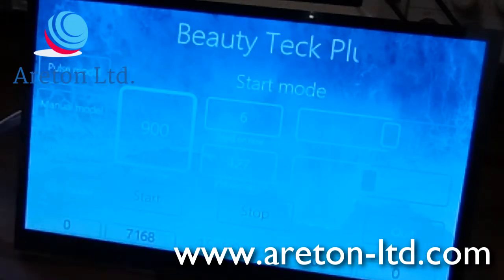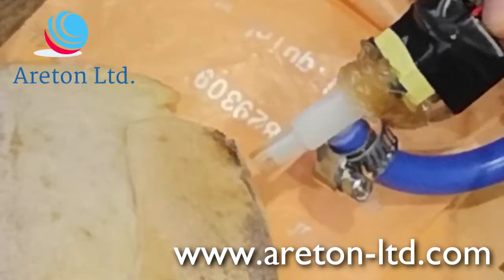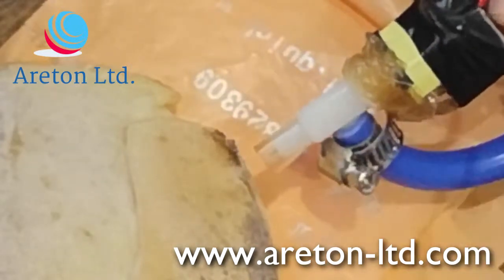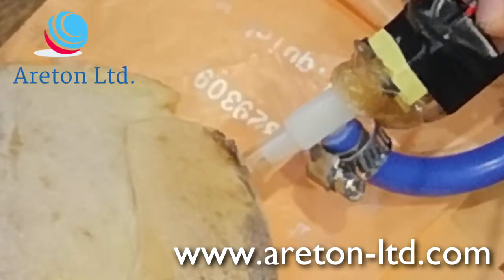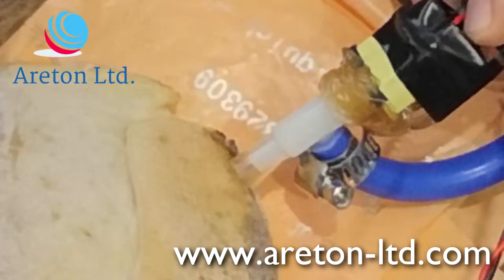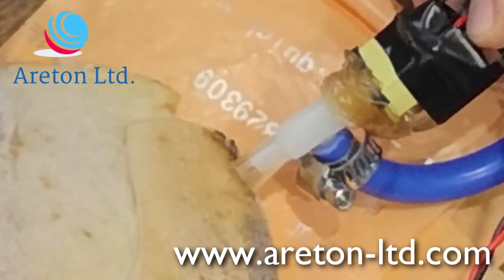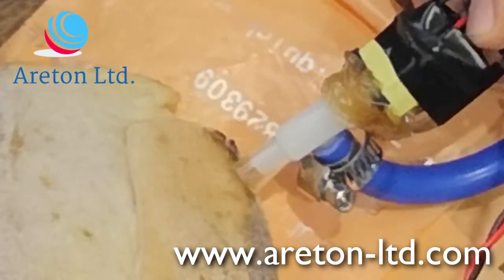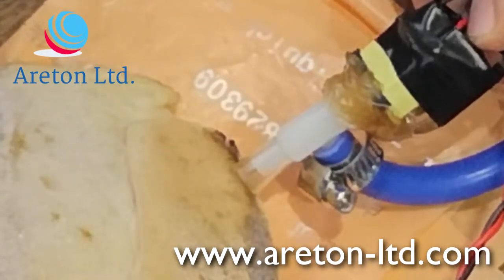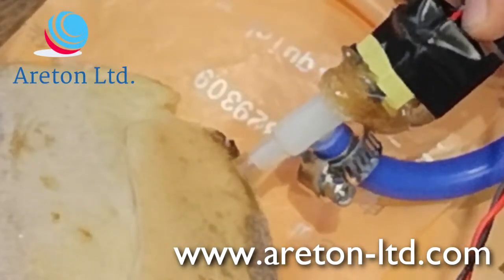What I'm going to do here, just to show you the argon gas and how it works in cold plasma, I'm going to switch on the argon flow, which is flowing through the tip and goes out. So all I'm doing is switching on the argon, and then we've got the flame. Wait 6 seconds. I've got the flame again. Now it's off. After 6 seconds, it's going to come on again.